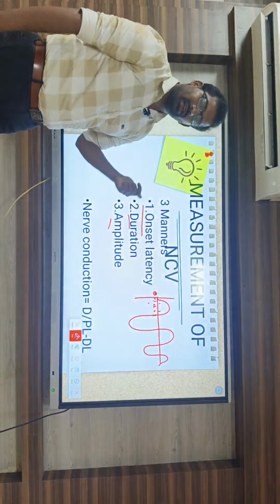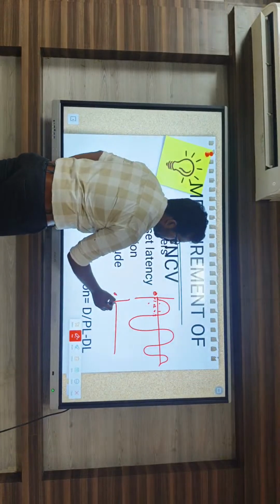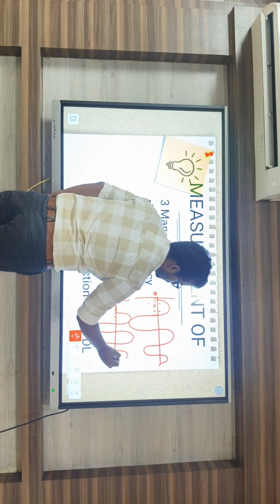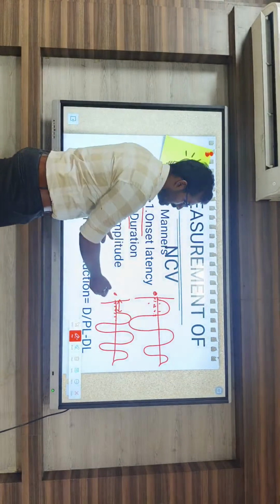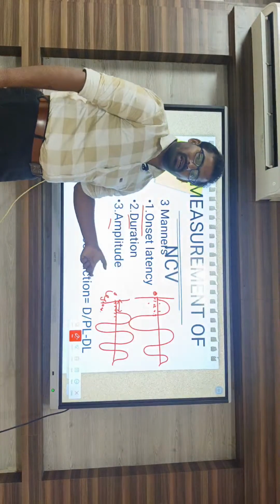So if there is a lesion, it takes some period to get muscle contraction. Okay. So in this period, we can't get any muscle contraction because of the lesions located where we are going to give the treatment.